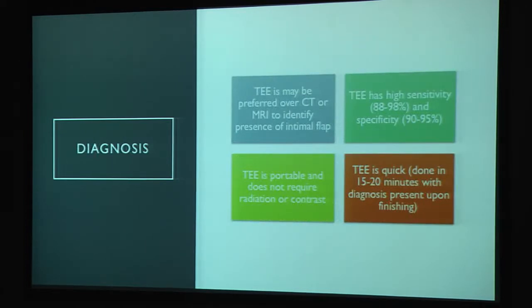So diagnosis, I know there's some discussion about this in the aorta talk. TEE may be preferred over the other modalities, and this is because it has high sensitivity and specificity. It's portable, doesn't require radiation or contrast. It's quick, done in 15 to 20 minutes.